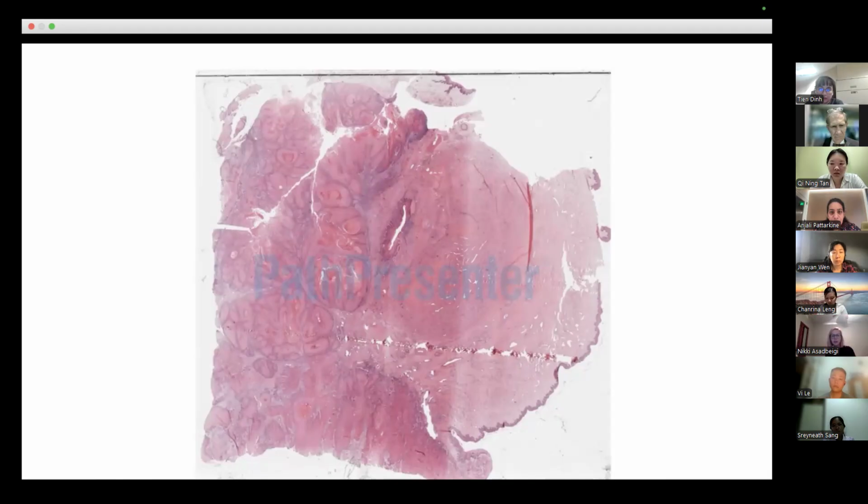Many of you have seen these big condylomas, and all of them seem to have pushing borders. It's just because it's a tangential cut, and they're large. So the diagnosis of this is not easy. The good news is that these are very indolent malignancies and are not going to act like those crazy big squamous cell carcinomas.